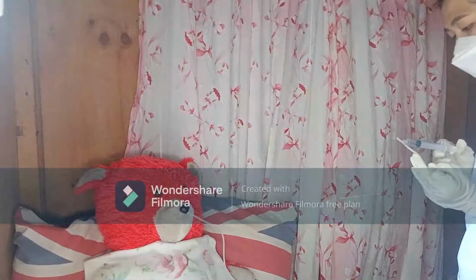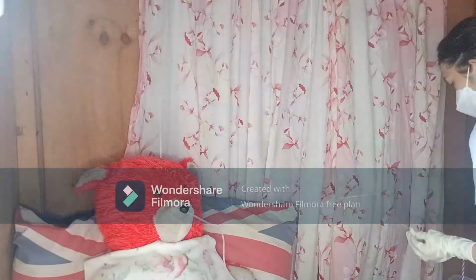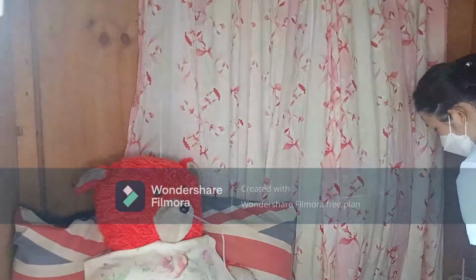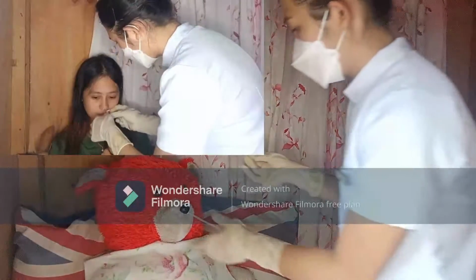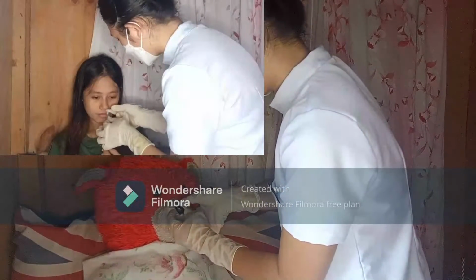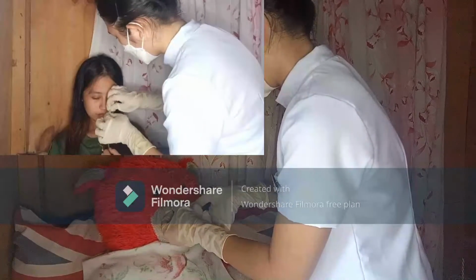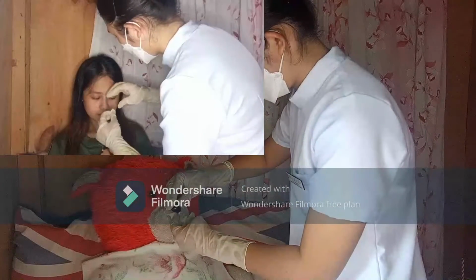Historically, nurses placed a stethoscope over the client's epigastrium and injected 10 to 30 mL of air into the tube while listening for a whooshing sound. Then, secure the tube by taping it to the bridge of the client's nose.